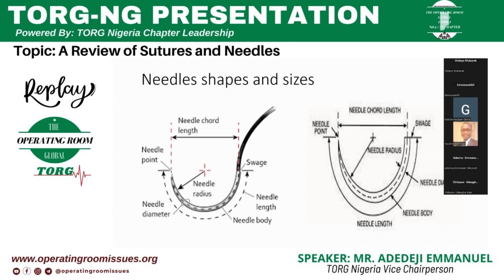So basically, what you have here is the needle point, the diameter, the needle body. These are the peculiarities of the needle. And of course, we have the cutting needle. We have the reverse cutting. We have the blunt.